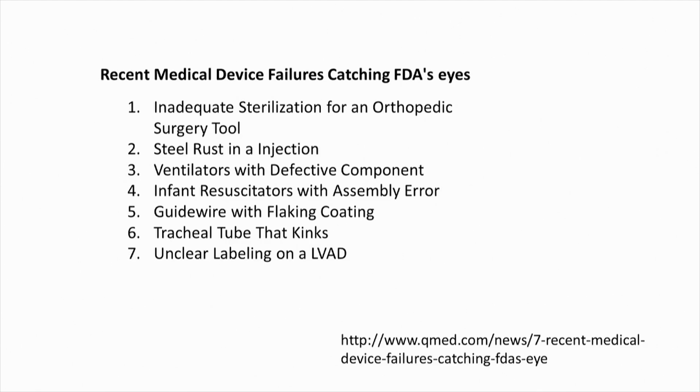So, the FDA has also observed many recent medical device failures, and they have listed them. Inadequate sterilization, as you can see, leading to bacterial infection, is the most important. Inadequate sterilization for an orthopedic surgery tool, rust in an injection, ventilators with defective components, infant resuscitators with assembly error. So, if you have multiple parts which need to be assembled, there could be assembly errors.